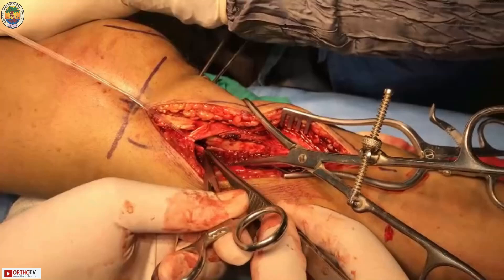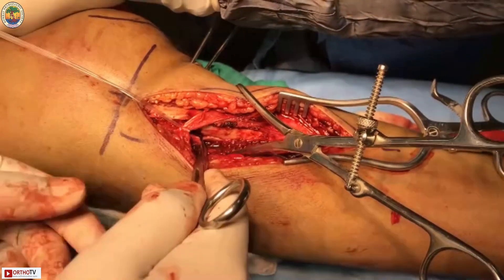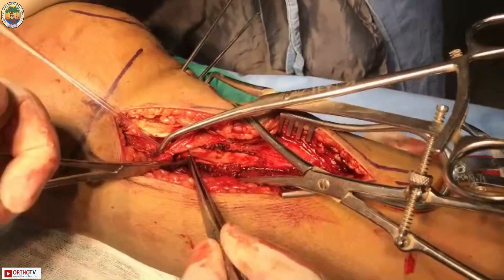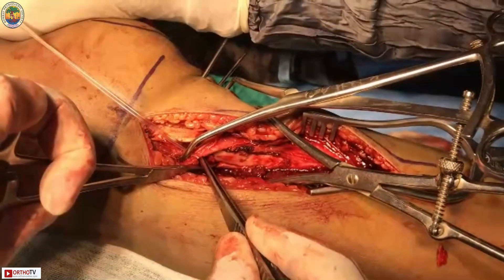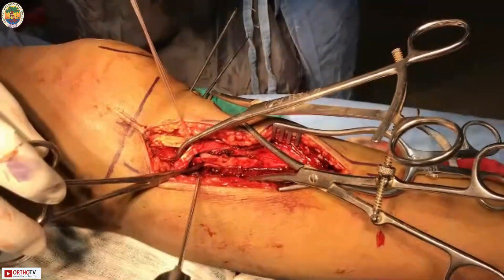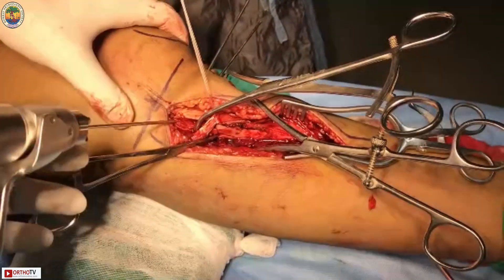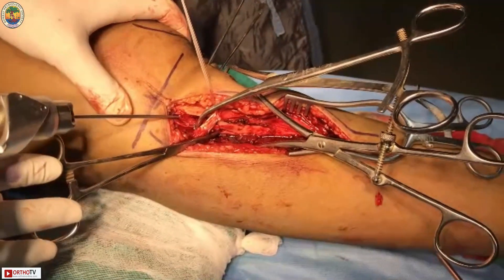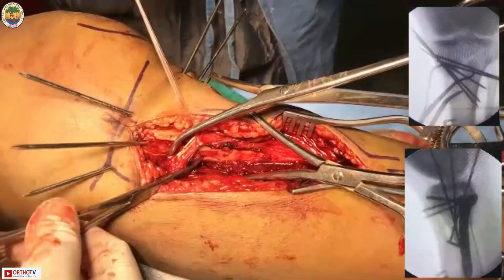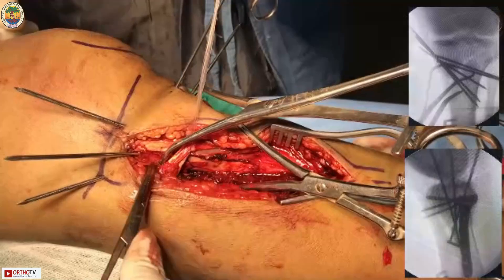The proximal fragment and distal fragment are identified. Traction is applied in a straight line with slight external rotation to slowly reduce the fracture. Once reduced, it is fixed with the towel clip and then stabilized with a temporary K-wire from the proximal to distal fragment. Three wires are placed in different directions and the reduction is confirmed as stable.